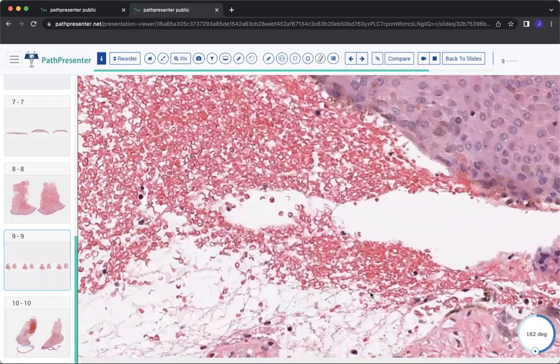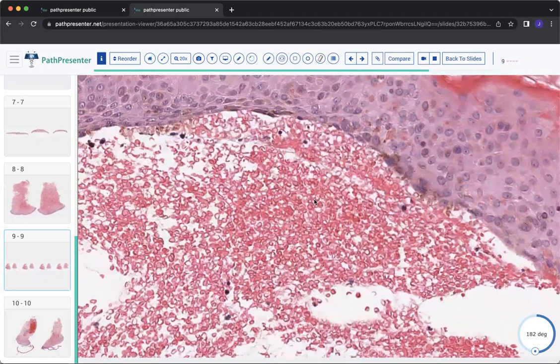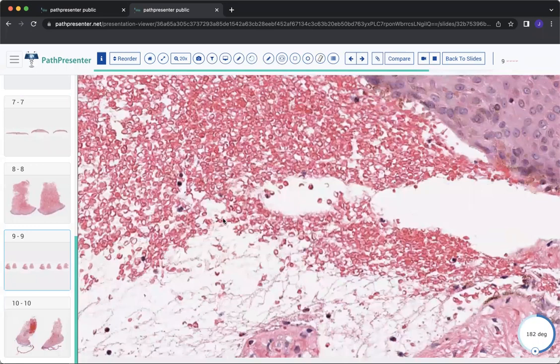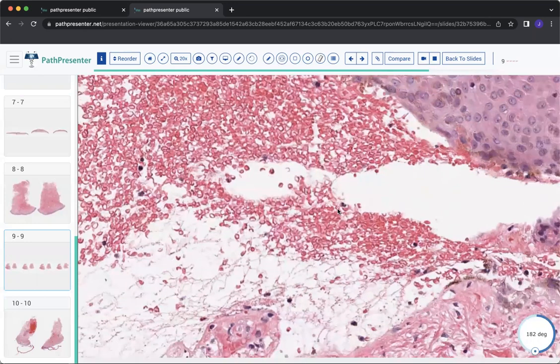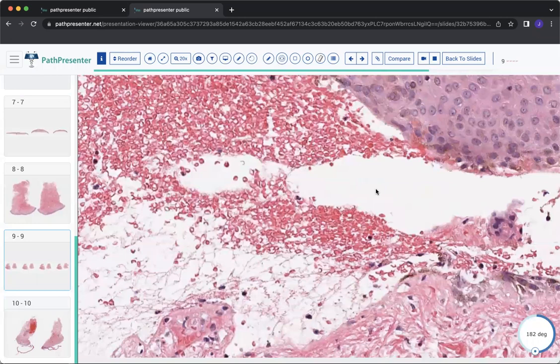How do you tell, if those are both in your clinical differential diagnosis and you get a subepidermal blister like this? You do a perilesional DIF and you see IgG and C3 linearly along the basement membrane. Can you say that it's not EBA? Can you say that it's not bullous pemphigoid? No, it could be either of those.